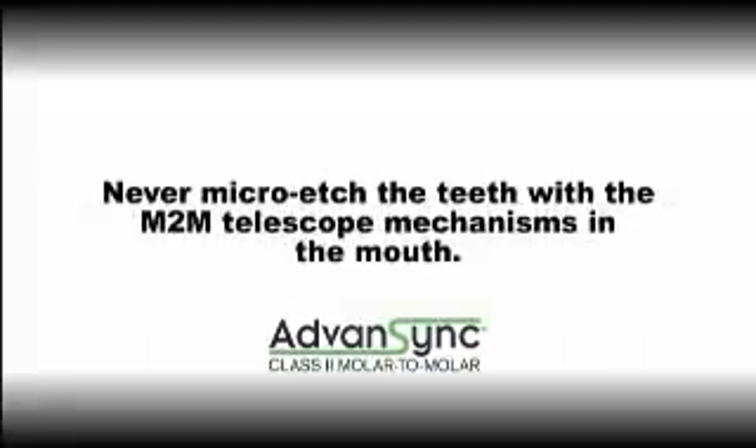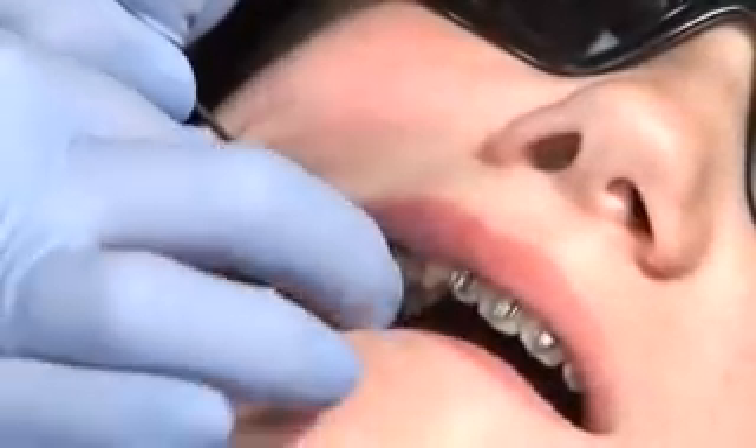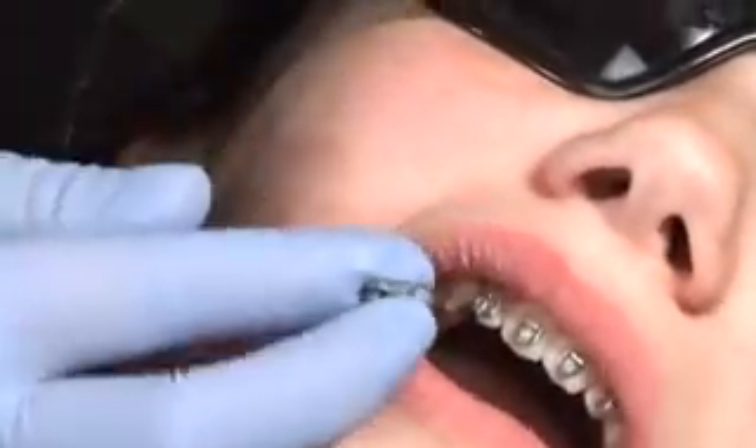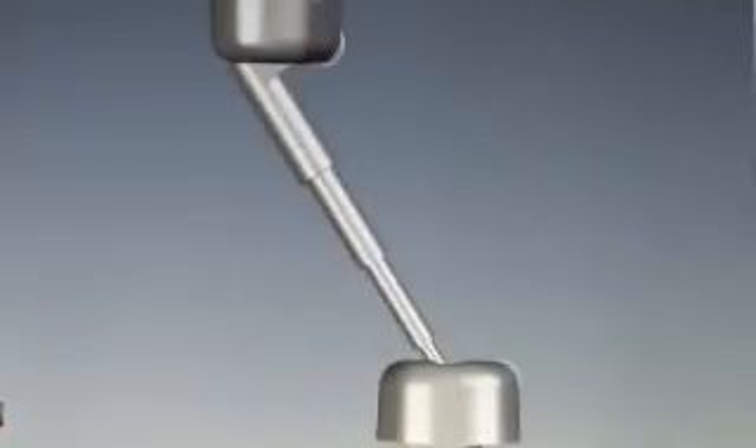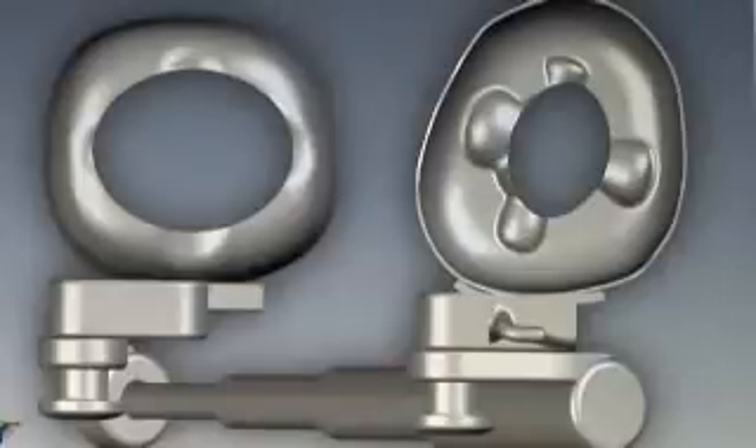When bonding or rebonding teeth, never micro-etch the teeth with the M-to-M telescope mechanisms in the mouth. Unscrew the mechanism from the upper and lower crowns and completely remove it from the mouth. The micro-etch material is so fine that it will sift into and get lodged in the telescoping tubes of the mechanism, keeping it from functioning. Ultrasound cleaning is proven incapable of removing the material.